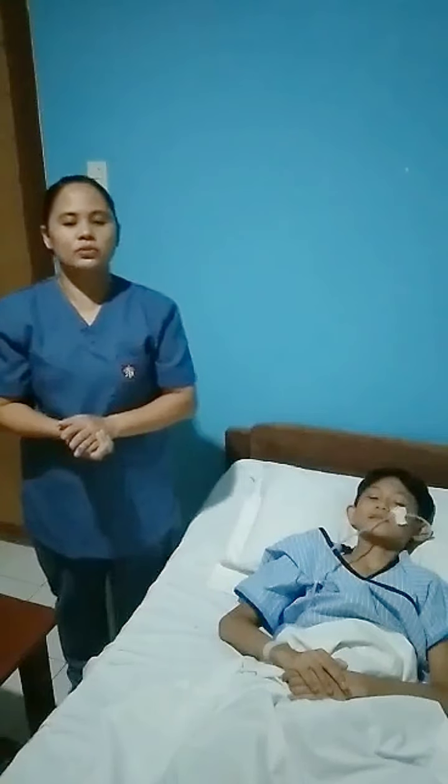And also, the next thing to do is to drape our patient's chest with a towel to prevent the linen and the gown from getting soiled.